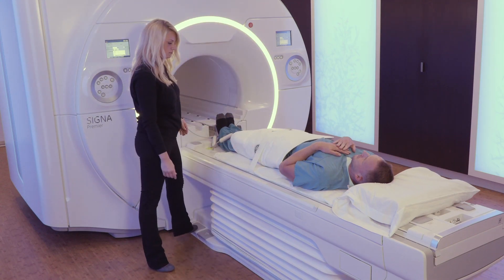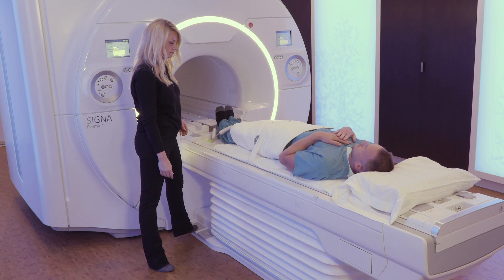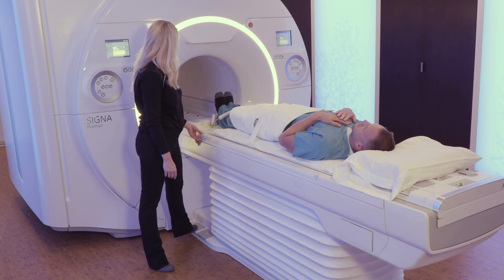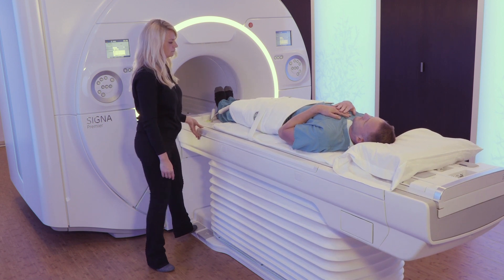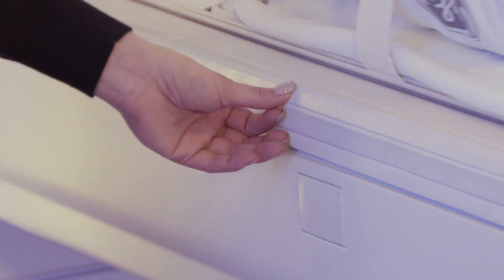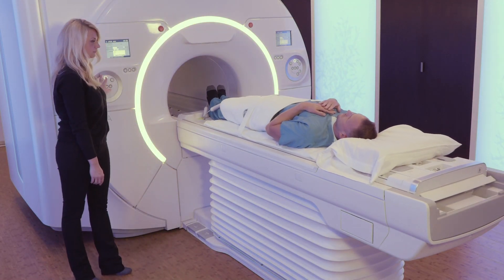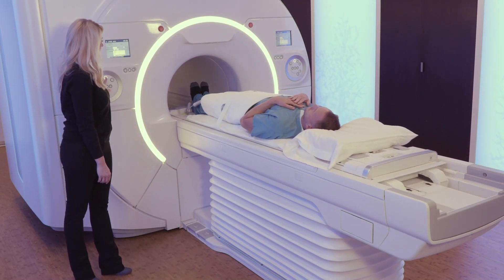As always, remember to use proper padding for any MRI exam. Use the IntelliTouch Strip to do a quick and easy one-touch landmark of the patient. And now you're ready to scan.